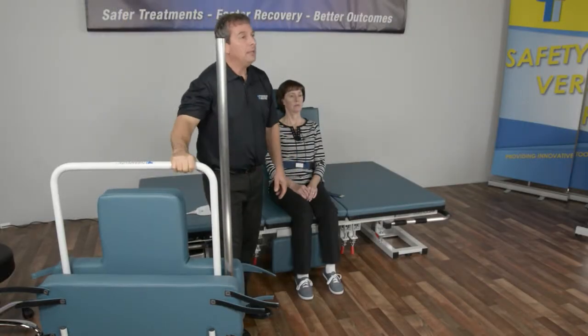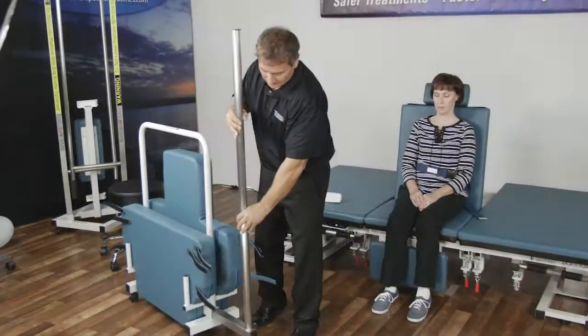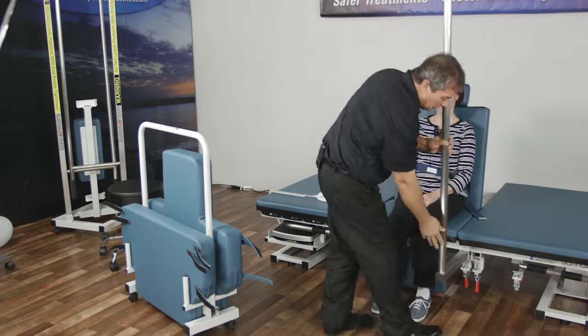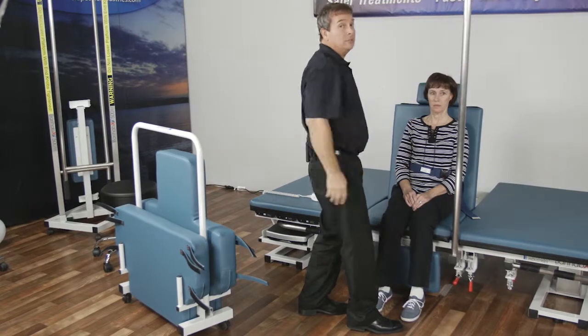The standing pole stows away in the cart — the same cart that the chest plate and knee board comes with. Once you slide it out you can use either receiver bar, lock it in place, and the standing pole is installed.